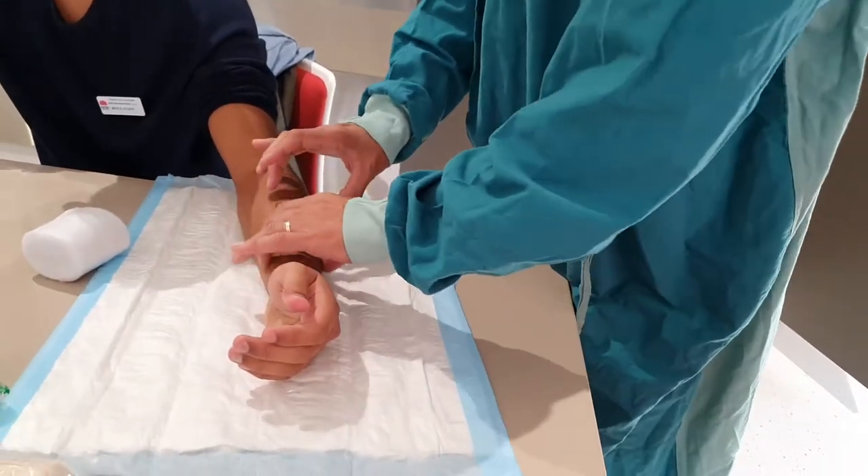Hi guys, today I'm just going to be going over plastering, and I'm just going to go over doing a backslab. What we're going to do now is simulate that there is some kind of fracture here.